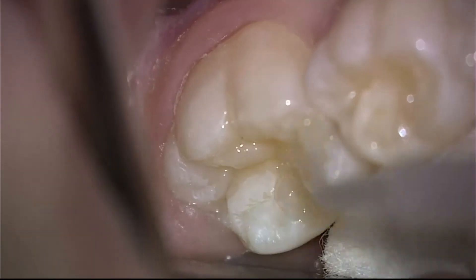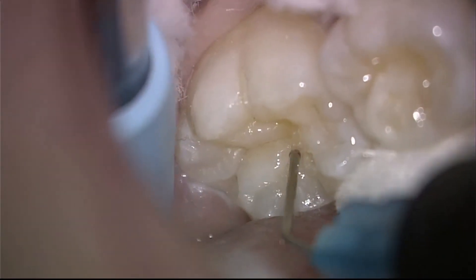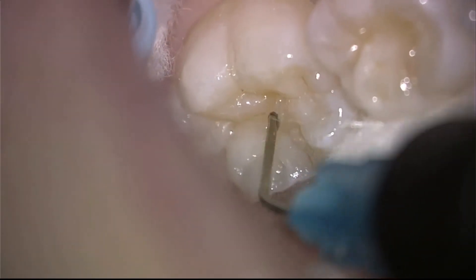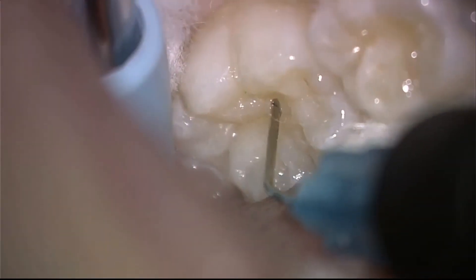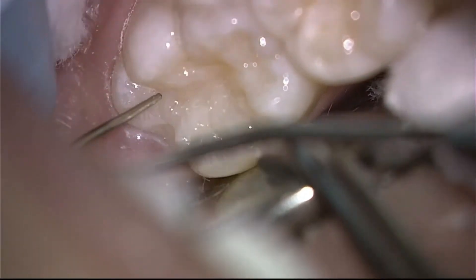This is the bonding procedure which starts to penetrate into the enamel pores. This is the permanent filling material, flowable, being placed into the grooves. We will cure that and once again we have a beautiful final restoration that should last many, many years to come.